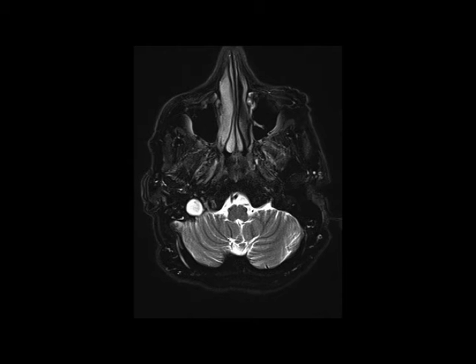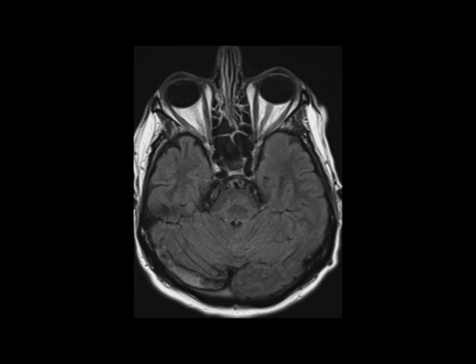The axial T2-weighted image demonstrates increased T2 signal intensity in the distal transverse and proximal right sigmoid sinus on the right, with additional increased T2 signal intensity at the proximal right internal jugular bulb.